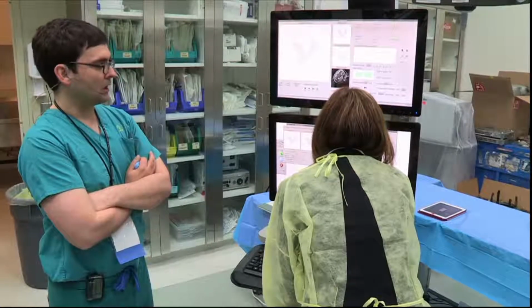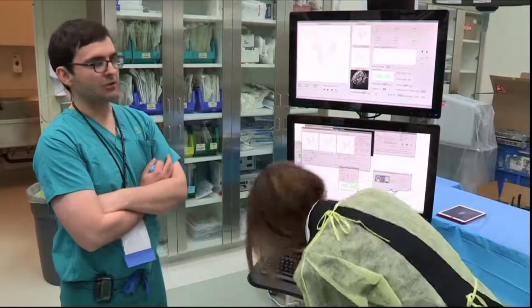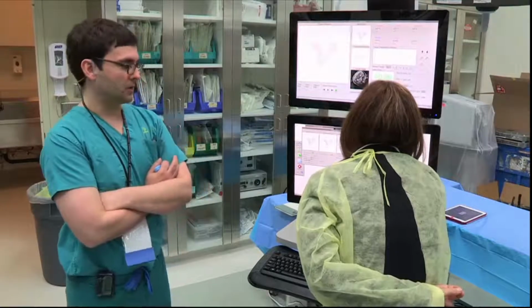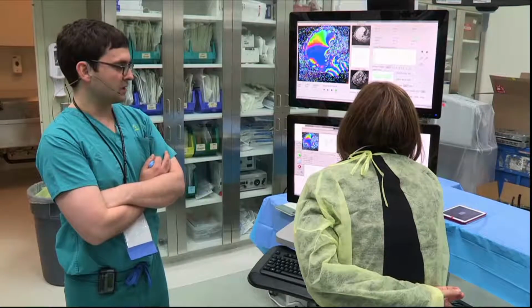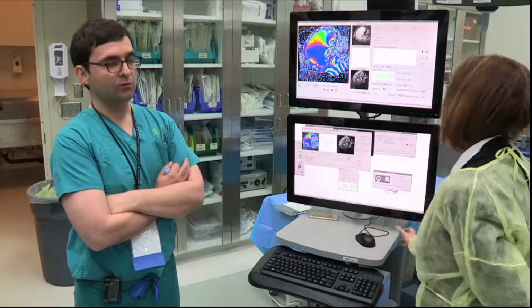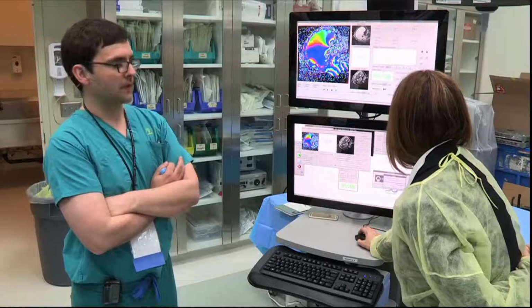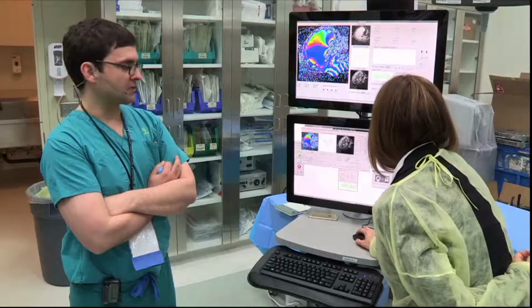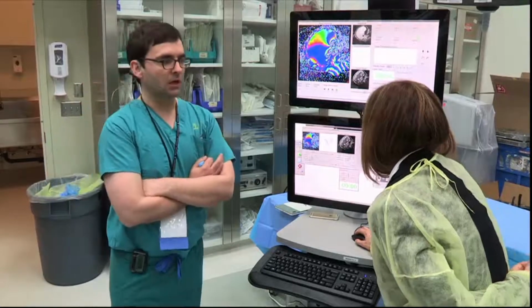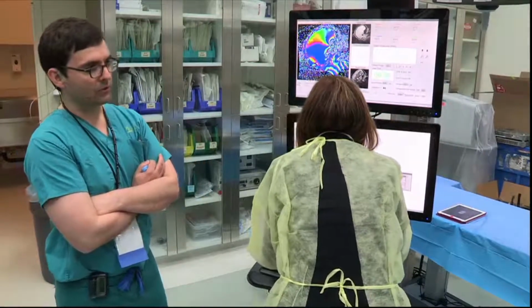And so you want to, and we'll do this shortly, set your boundaries or your safety points for your software. So 45 degrees is going to be set around the superior, or the roof, of the lateral ventricle, where our optic radiations are, at the ambient cistern just lateral to the cerebral peduncle, or even the base of the basal ganglia when you're burning.